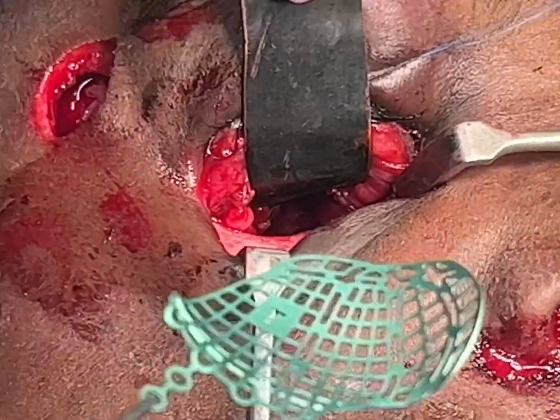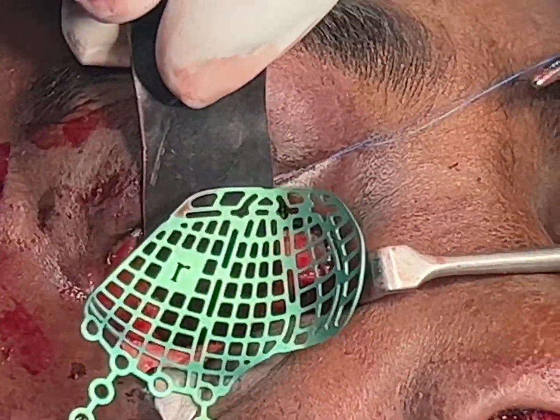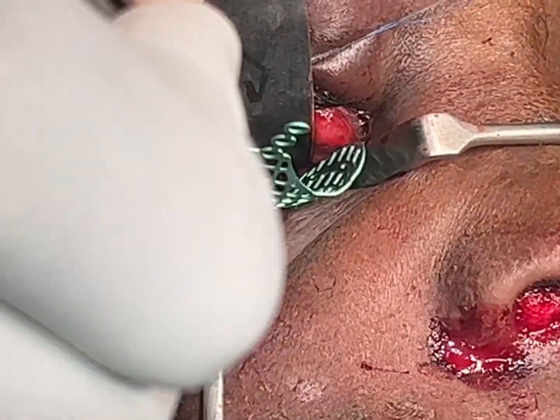The orbital floor is going to be reconstructed with this orbital floor and medial wall reconstruction plate.